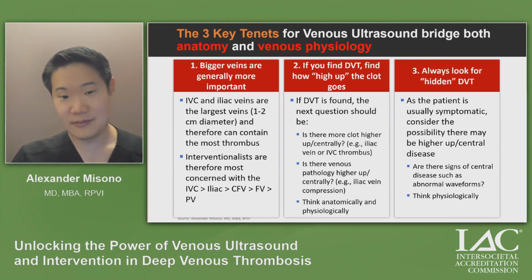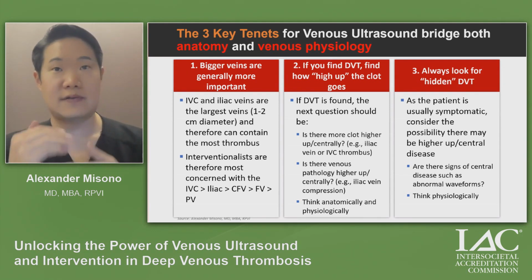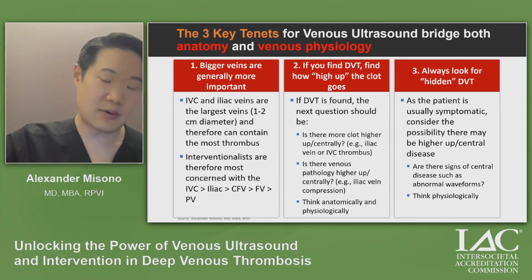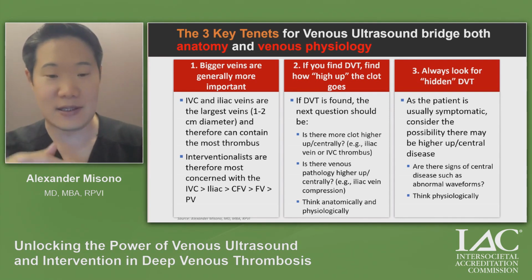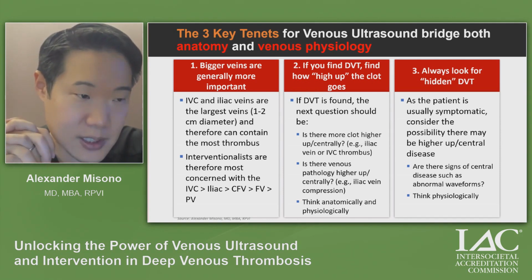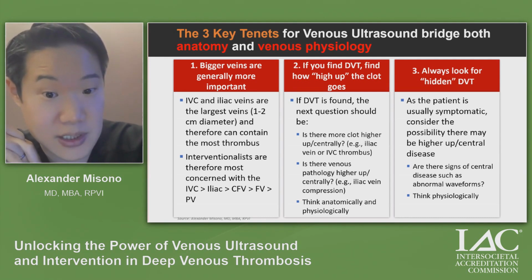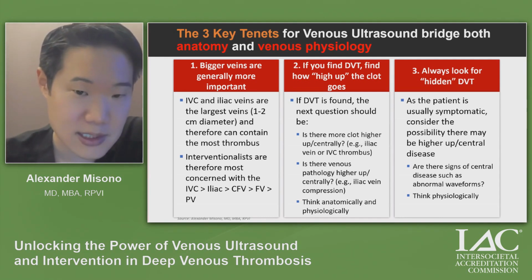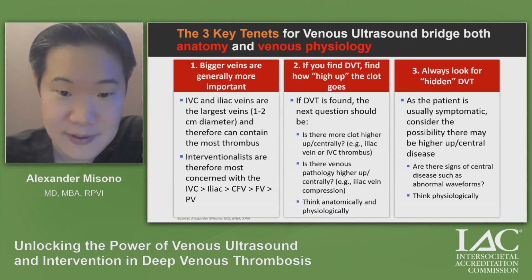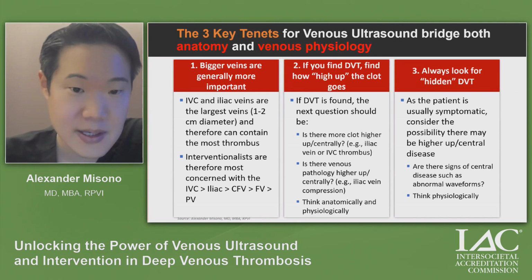Is that possible? The answer is, of course, yes, it is possible. And so instead of simply checking off boxes that we checked those veins for thrombus and they were there or they were not there, I would like us to be thinking physiologically about that question of what's actually going on inside of this patient and have the curiosity to ask that question and potentially go and look at it, right? You may need to get an order or whatever the protocols would be to actually go and look at the iliac veins in the IVC, which is in fact quite possible to do in many patients.